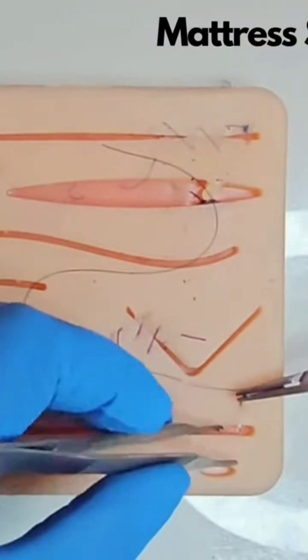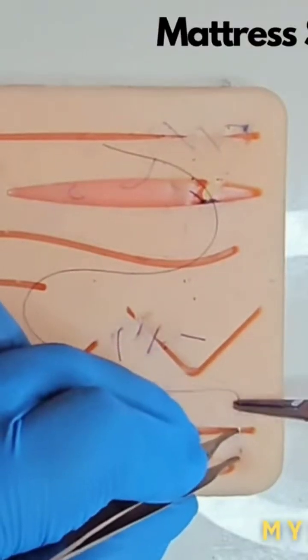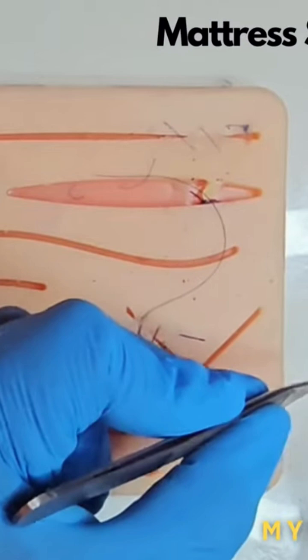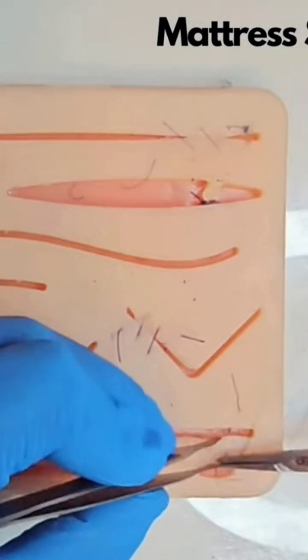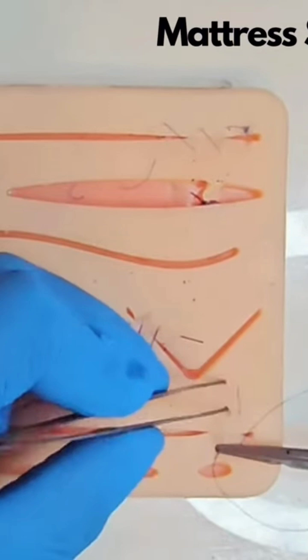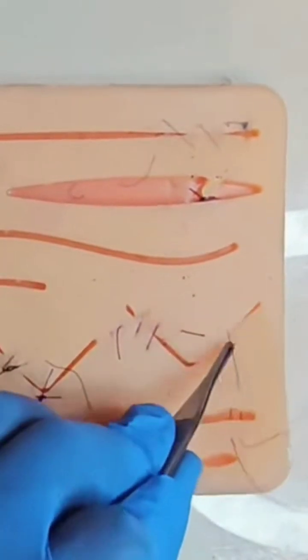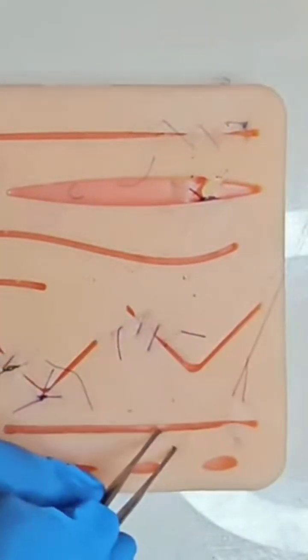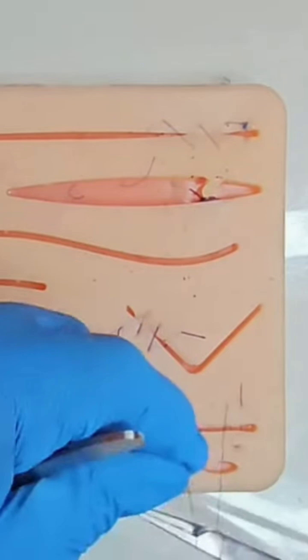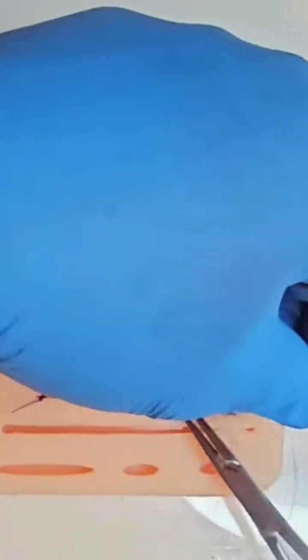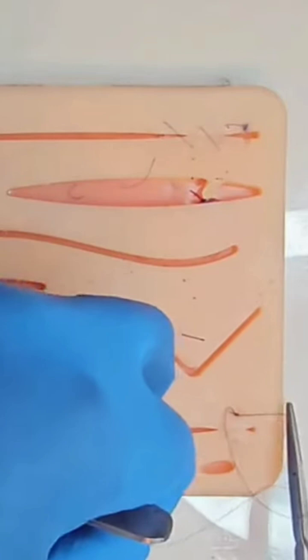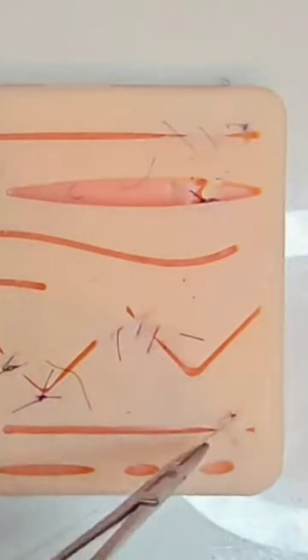Going to smash through three types of mattress suture. The horizontal mattress: you go across the wound like an interrupted, but you take two further bites. The third next to the second, heading back across the wound and exiting opposite and next to the first. You perform your surgeon's knot followed by two reef knots. This is excellent for wound eversion.